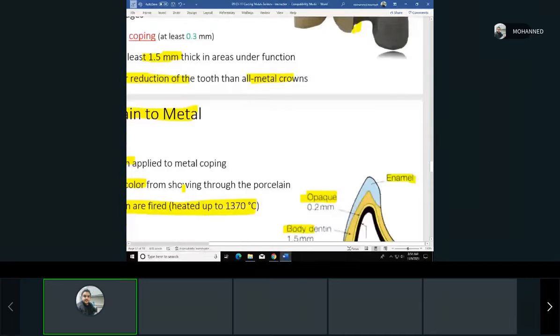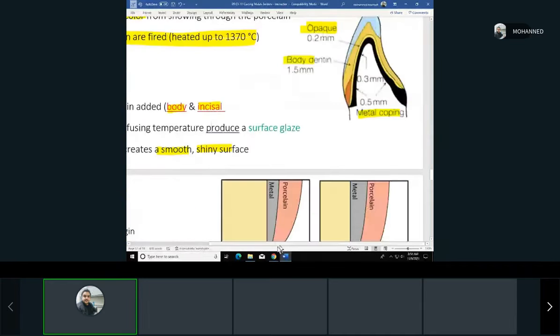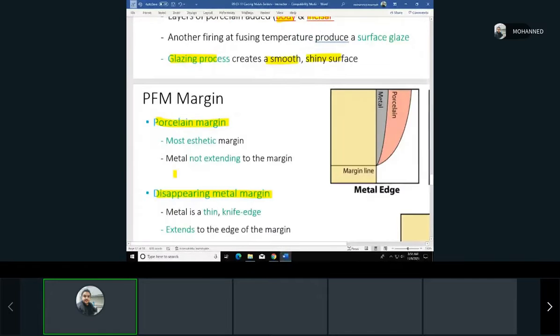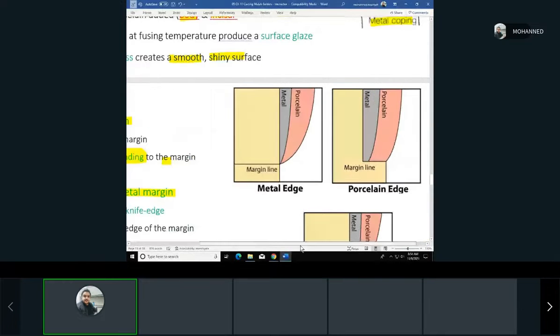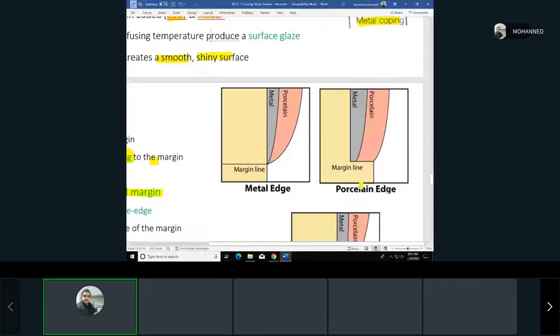This is about the ending, how the lab would fabricate it, and we can tell the lab technician how we want it to be made. So this is how the porcelain fused to metal would sit on the tooth. With a porcelain margin, which is the most aesthetic, you will not see the metal in the patient's mouth. You will not see that part extending. So where's that porcelain edge? You can see this is the tooth. We only see the porcelain.